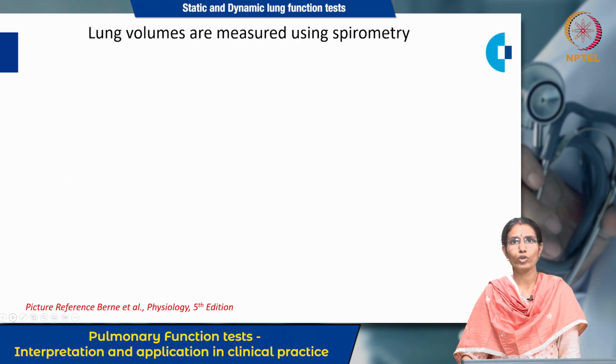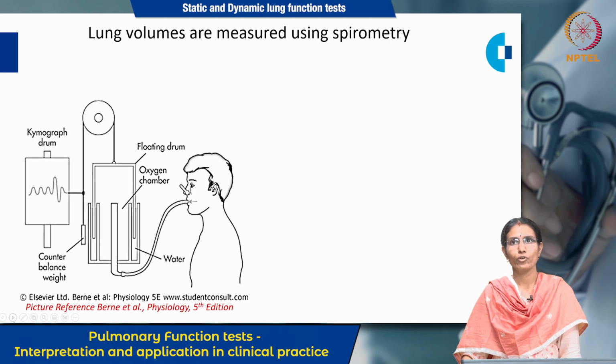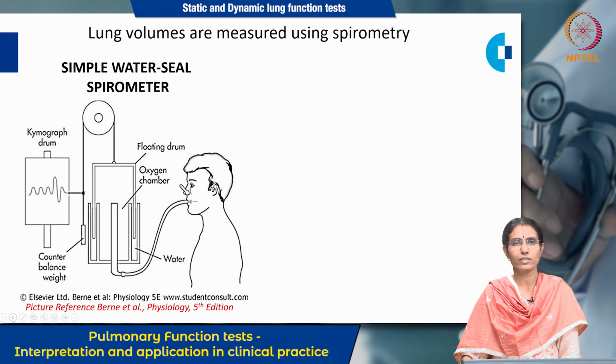And these lung volumes are all measured using what technique? Using spirometry. You have studied already about the different types of spirometer in module 1. So this is the simple water seal spirometer, what you see. Here the person breathes through the mouthpiece with the nose clip on, and this is not used nowadays for clinical purposes. This is mainly used for teaching purposes, not even for research purpose it is used.